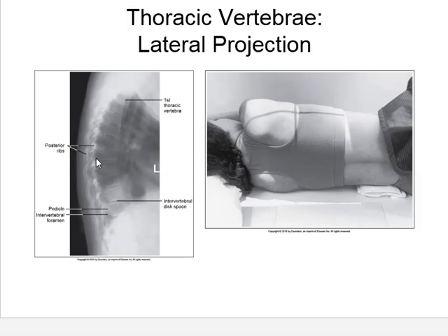So shallow breathing, if you're on a limited exposure machine, what I'd recommend you do, if like let's say 1 second is as long as you can get for a breathing technique, have the patient take in a big deep breath and slowly blow it all the way out and shoot pretty much right in the middle of the exposure. That'll give you some degree of breathing technique. Otherwise, you just look like you have a high contrast lung chest x-ray where you collimate it in.